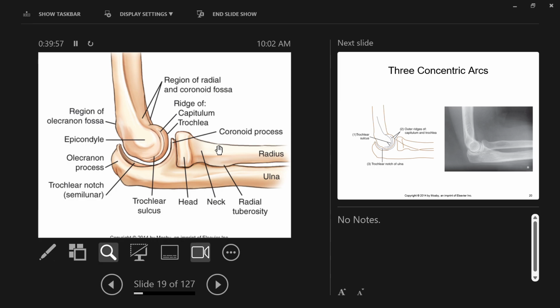So if a physician suspects a coronoid process fracture and says, hey, do you have any images that demonstrate coronoid process fractures? You know the lateral does that, and by the way, they will too, right? But I'm just giving you, they may not, right? But they want to see the coronoid process. There it is. It's there laterally, okay? We want to see the olecranon process. There it is. So our lateral gives us the olecranon process and coronoid process, easy to hurt things, okay?